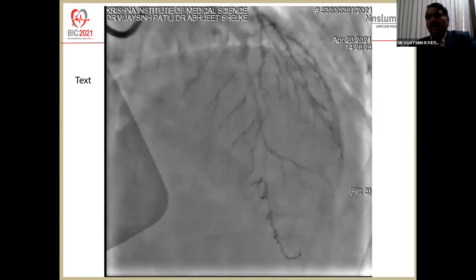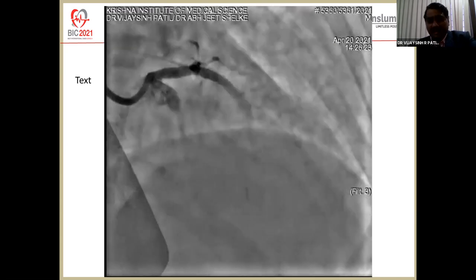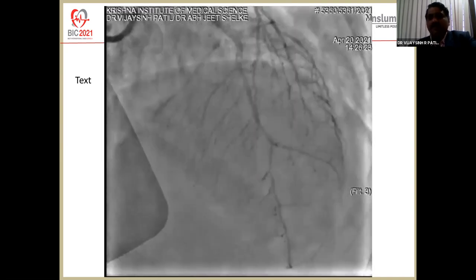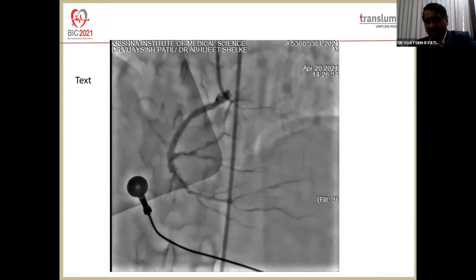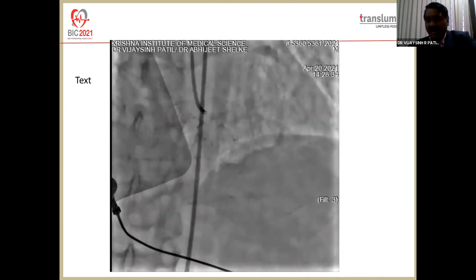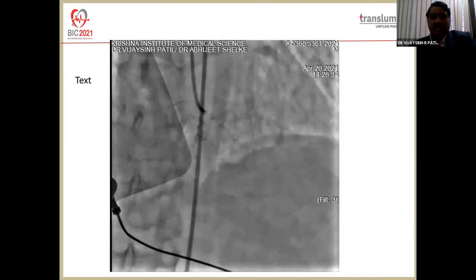He had some constant inotropic requirement for the next 2 to 3 days. But then he did have a good recovery without any acute renal failure or any sepsis. The right coronary was injected later after the procedure was over, and it was a dominant right coronary, explaining why he had almost safe sailing through that intervention.